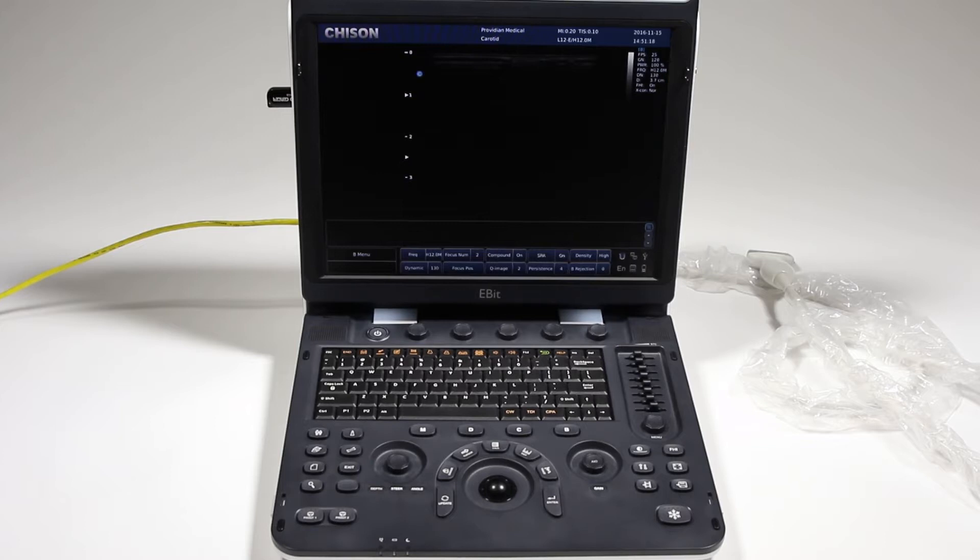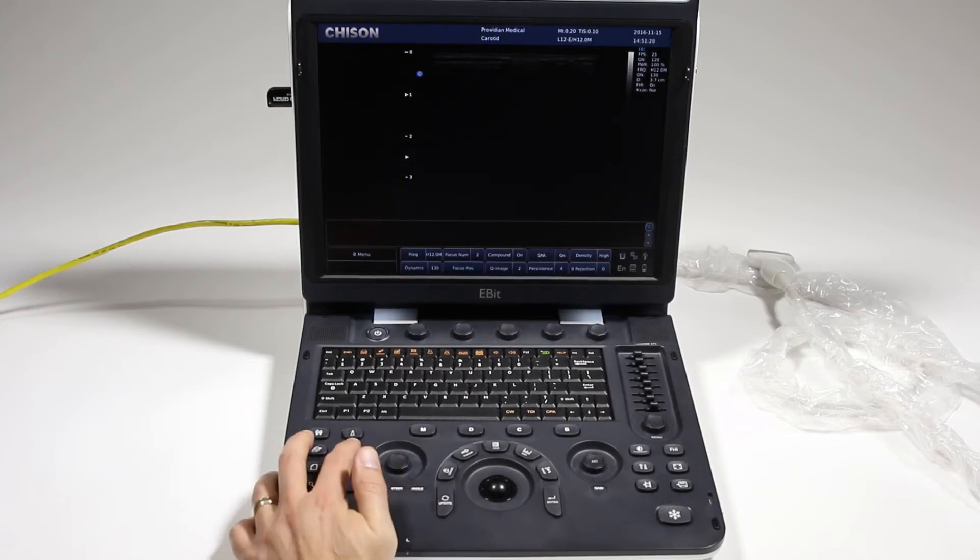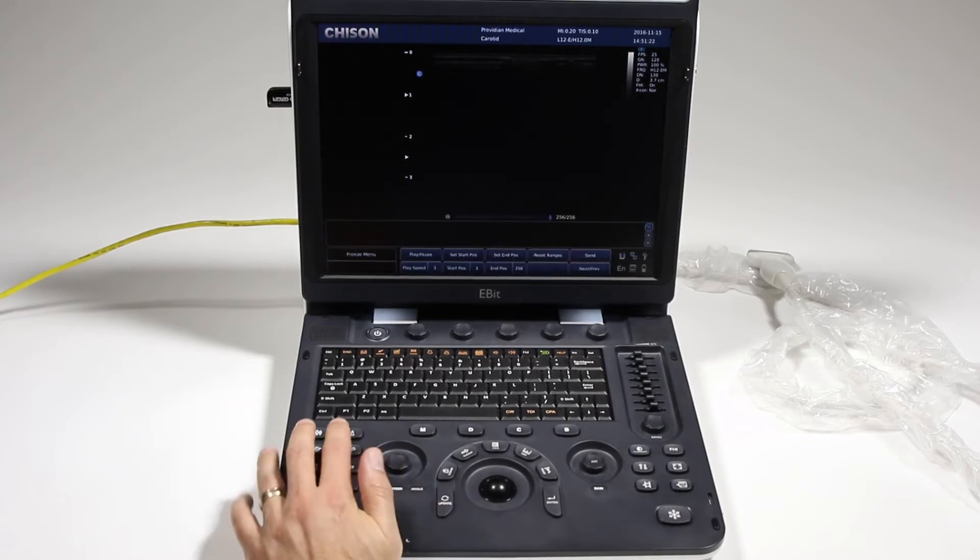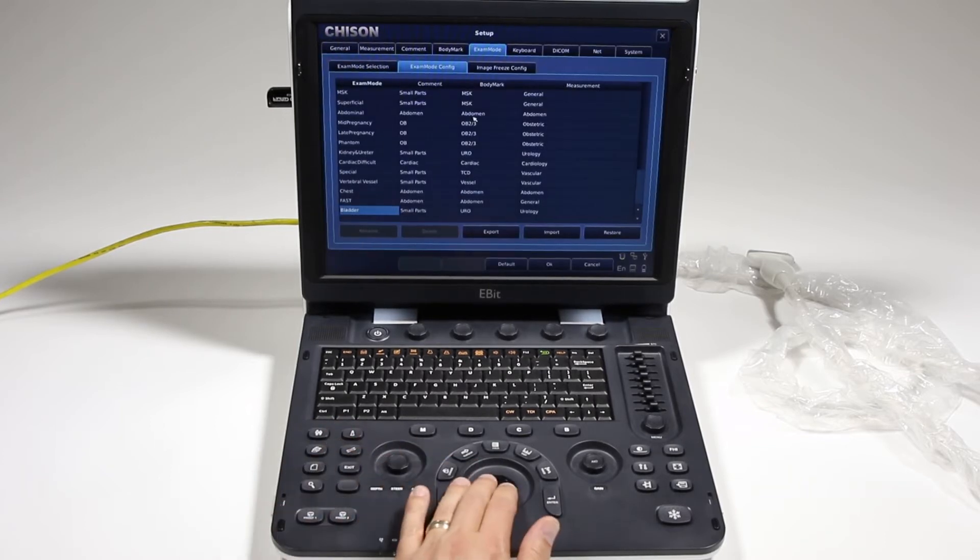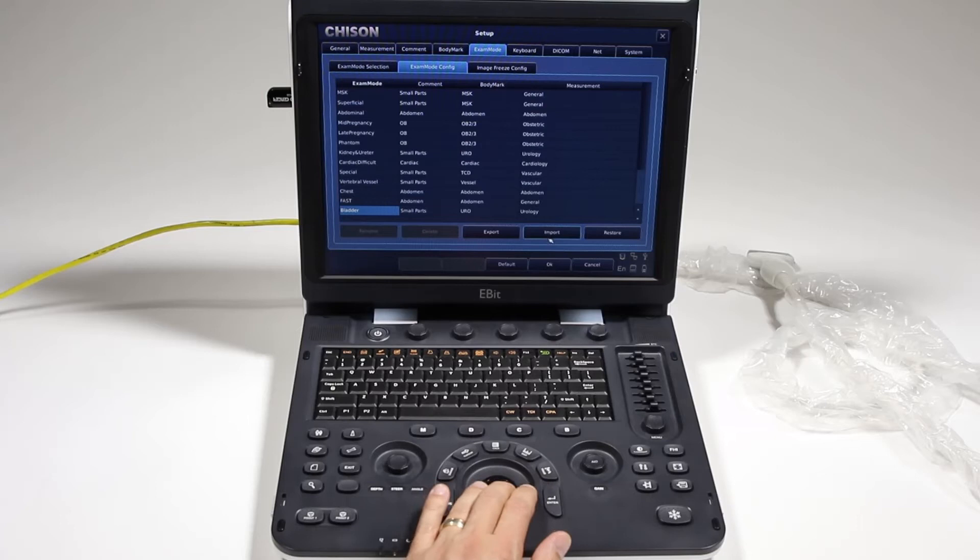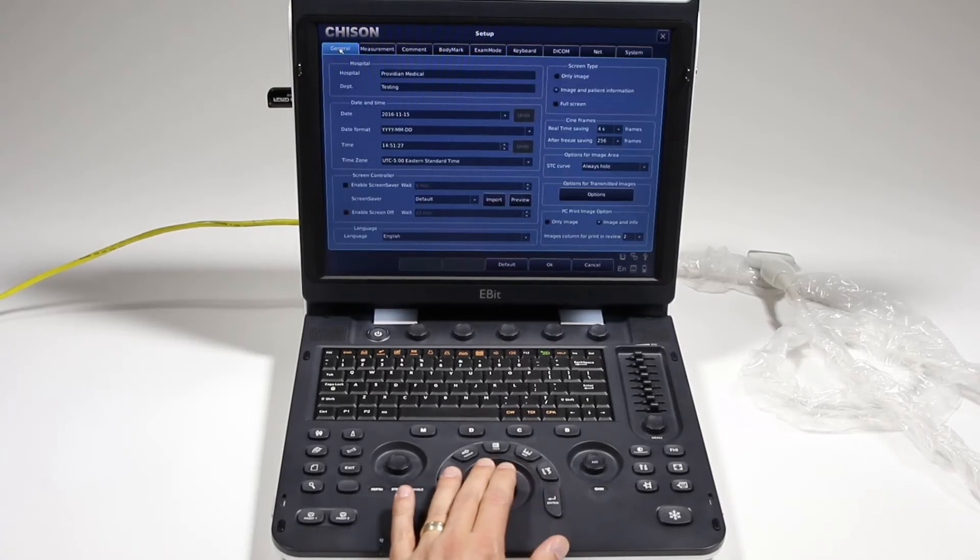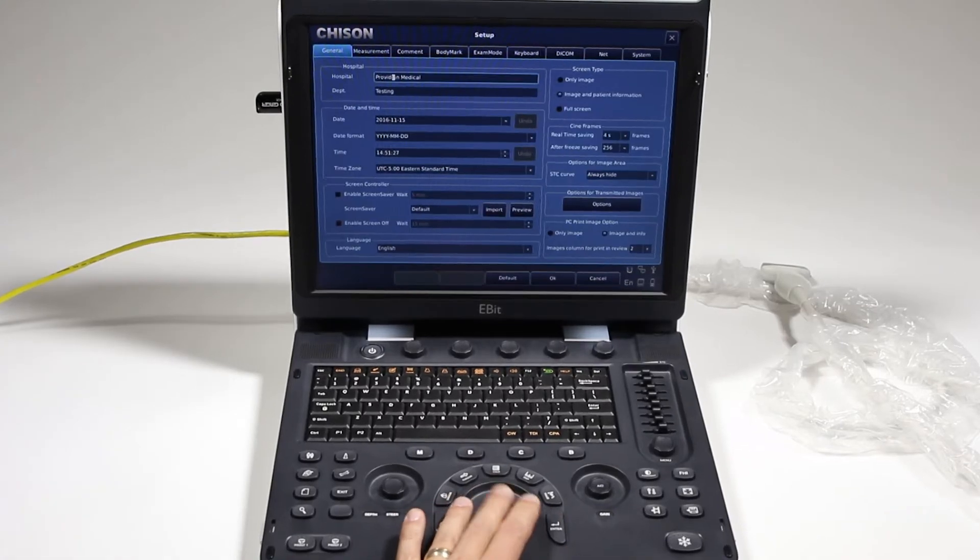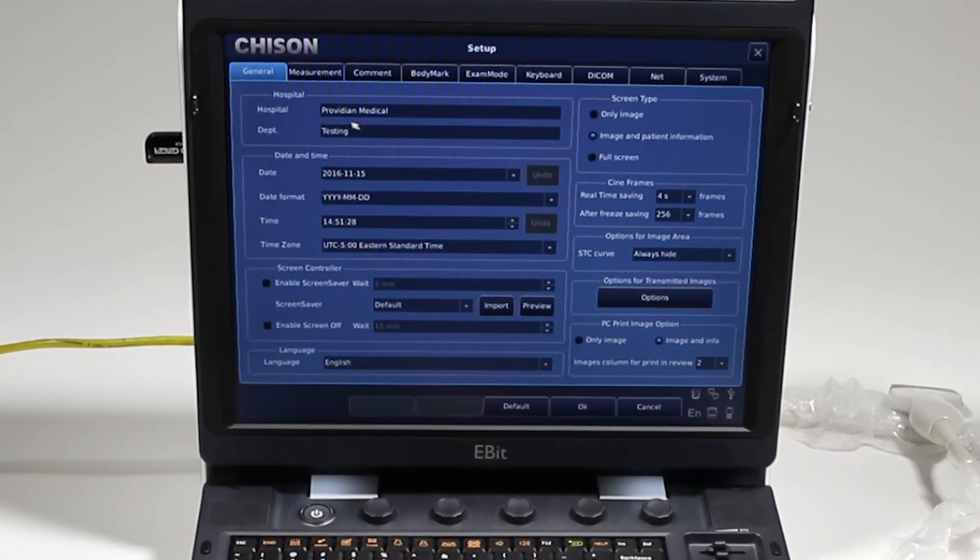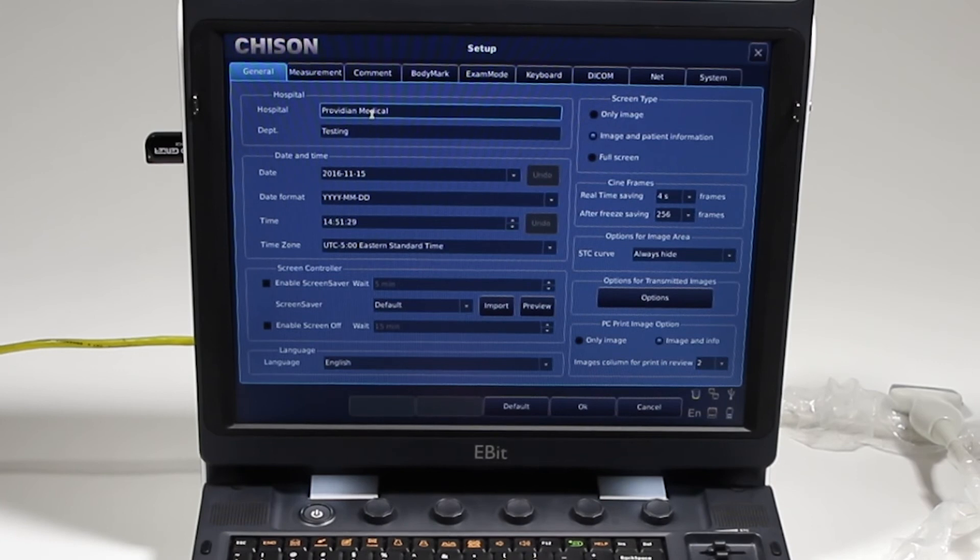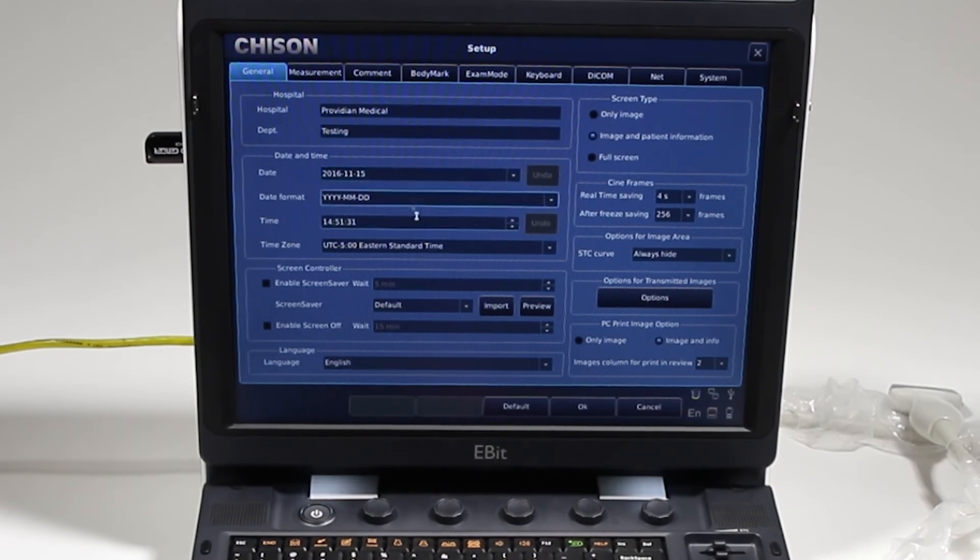Okay, getting the system utilities and setup, I'm going to go ahead and press this wrench icon. And it went back to where I was before, so I'm going to go back to the general and we'll walk through these screens together.